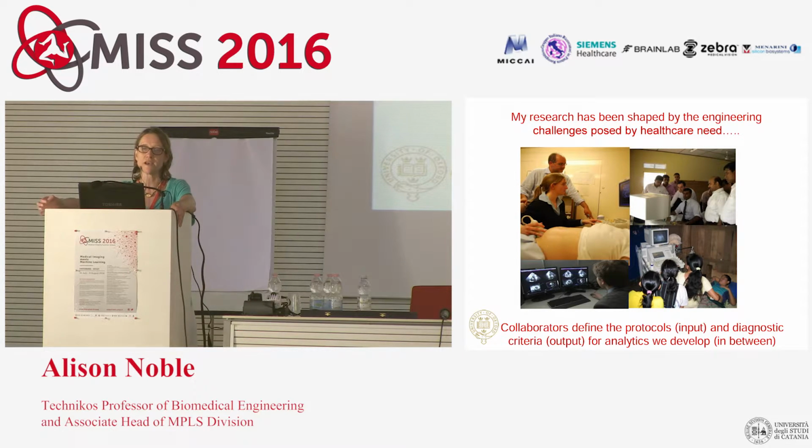Some of those needs, using ultrasound, can be quite different from the needs that you would meet if you were looking at MRI and CT in hospitals. You end up doing interdisciplinary research where the collaborators define the acquisition protocols, so that's your input. They also tell you what they're trying to find, so they define the diagnostic criteria, that's your output. And then it's the challenge of the image analysis people to develop the analytics that allows you to bridge the gap between the two.